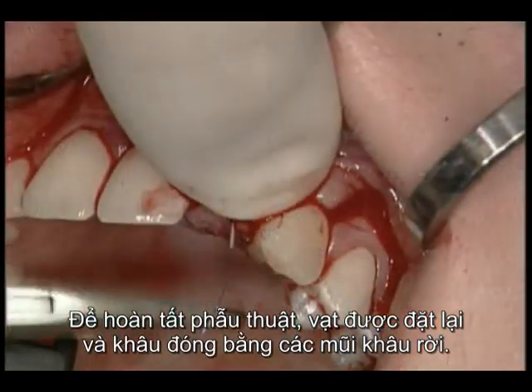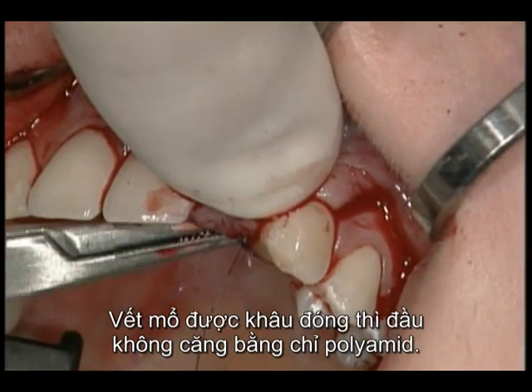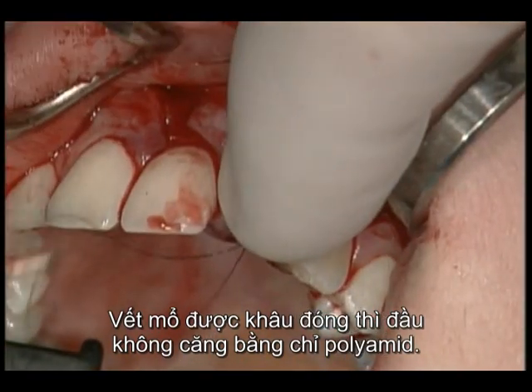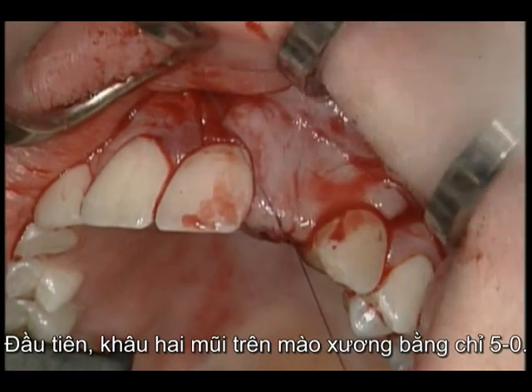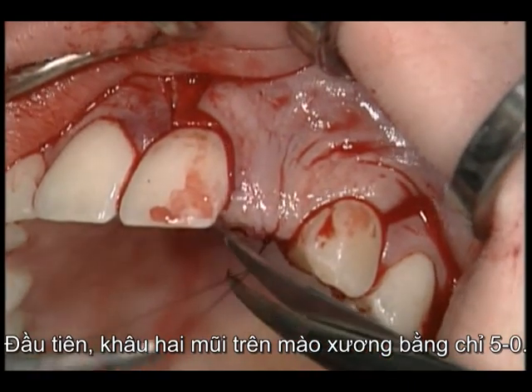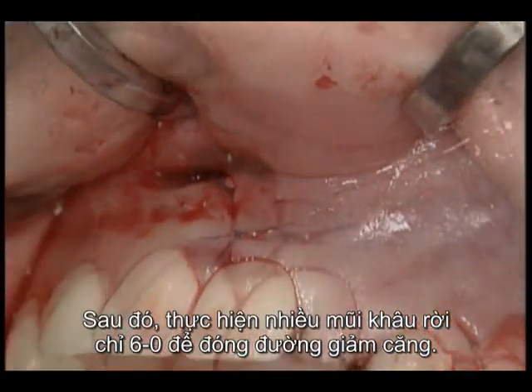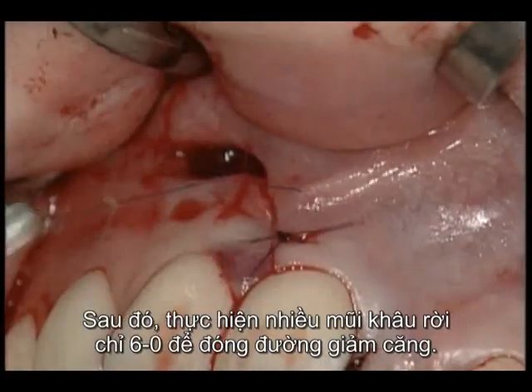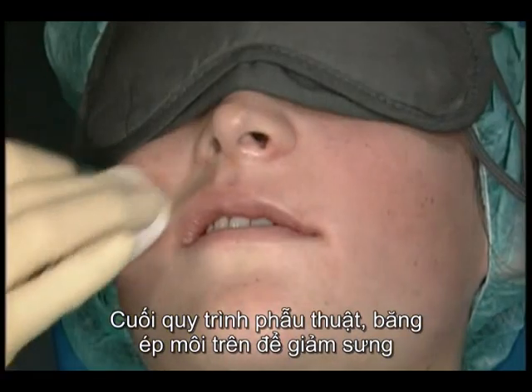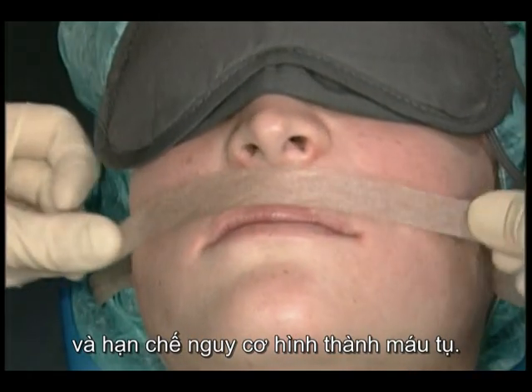To complete the surgery, the flap is repositioned and closed with interrupted single sutures. A primary tension-free wound closure is achieved using polyamide suture material. First, 2 crestal sutures are applied using 5/0 sutures. Numerous single sutures with 6/0 suture material then close the releasing incisions. At the end of the surgical procedure, a pressure dressing is applied over the upper lip to control the swelling and to limit the risk of hematoma formation.